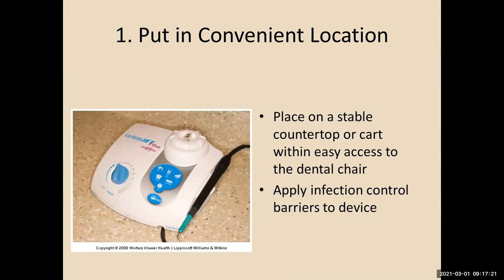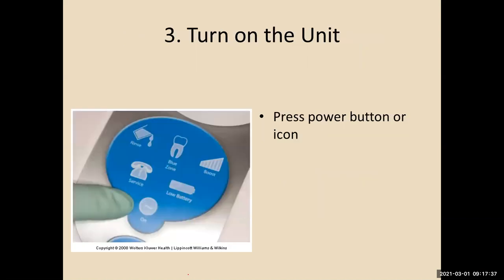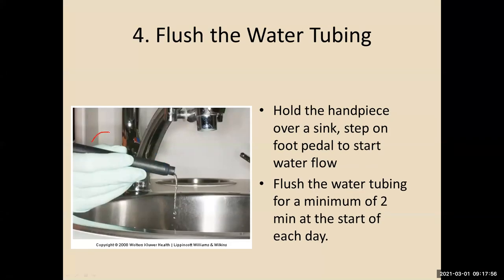We have the ability to have our units put into our chairs, so we don't have to worry about a separate unit and hooking it up. Most offices, even if you have a separate unit, it's hooked up all the time and you're not having to cart it room to room. When I was a student, we had to check out our ultrasonics and it was on a cart and we had to hook it all up just like your Prophy-Jet. And oh boy, was that a pain in the neck. So depending on your unit, now how long do you flush this for? Excuse me, minimum of 2 minutes.